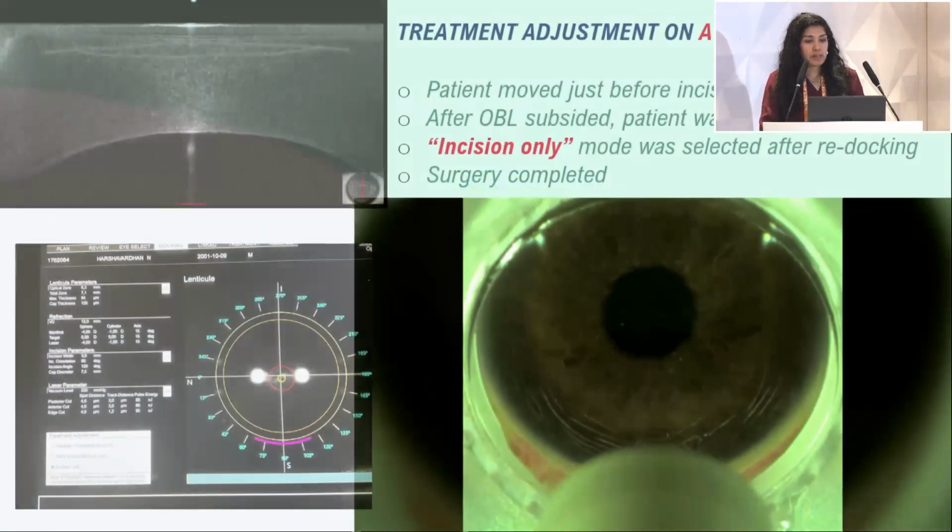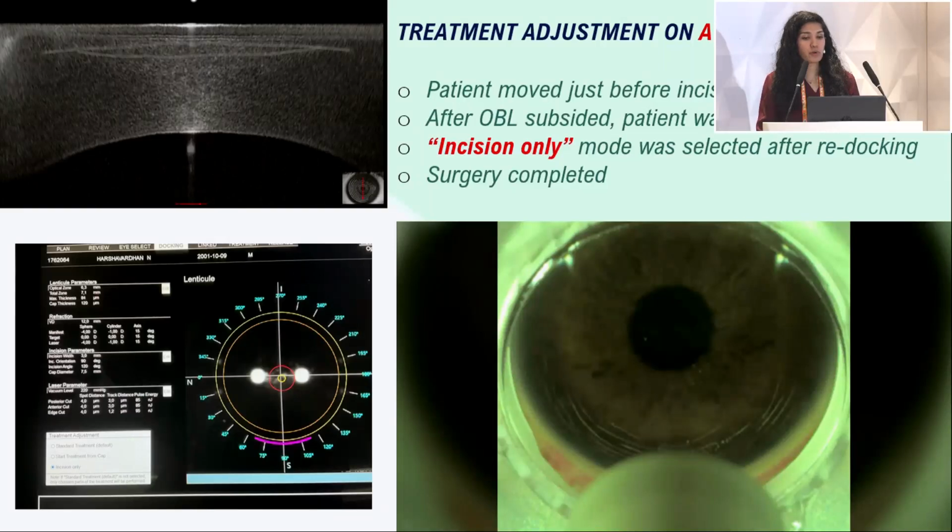But what happened is the patient moved just before the incision creation. So after the OBL subsided, what we did was we shifted back to the OT, and we selected the incision only mode after redocking, and then we completed the surgery.